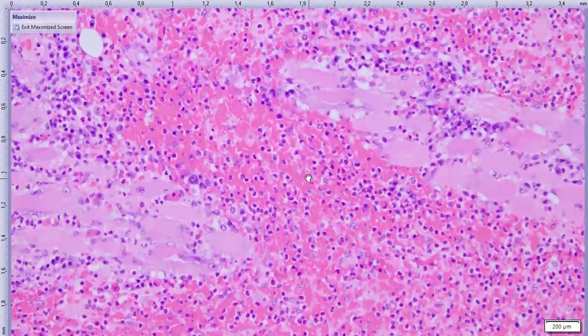So your differentials in a case like this could be, is this just purely an inflammatory population, at which point eosinophils would denote most typically a hypersensitivity reaction or response to parasites. So some sort of parasitism, maybe insect bite hypersensitivity, or maybe an actual parasite somewhere in the tissue that we didn't quite catch. Although certainly eosinophils are not specific to these two possibilities.